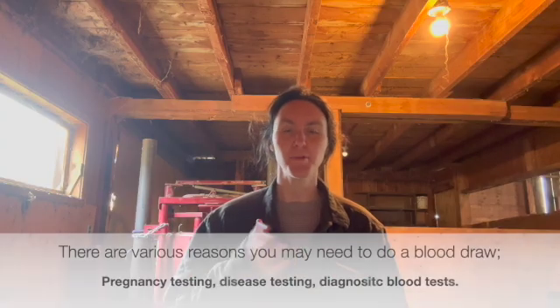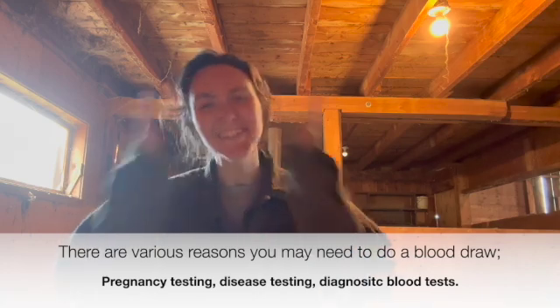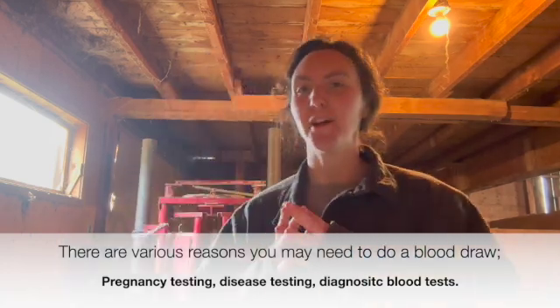So I have to do a pregnancy test. Spoiler alert, I already did it — it was negative. Oh darn. But I want to show you how to actually do the blood draw because I know it can be a little bit confusing and intimidating thinking that you have to do a blood draw off of your cow.